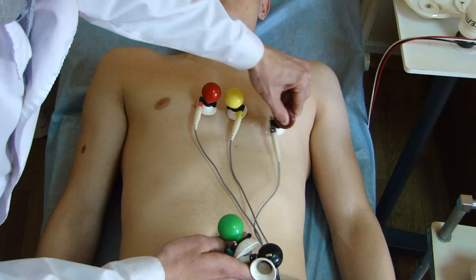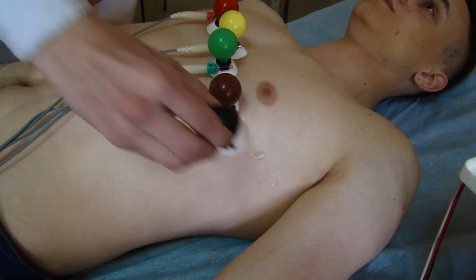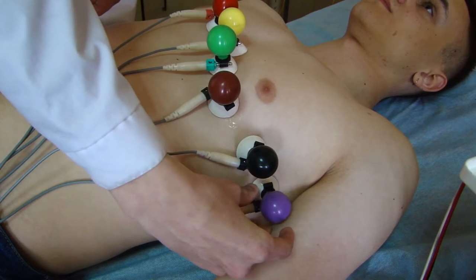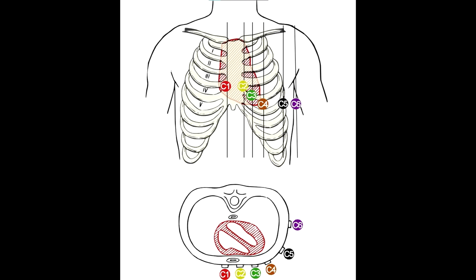Fourth electrode – brown, fifth intercostal space along the midclavicular line on the left side. Third electrode – green, applied after the fourth electrode, in the middle between the second and fourth electrodes. Fifth electrode – black, fifth intercostal space along the anterior axillary line. Sixth electrode – purple. The layout of the chest electrodes will look like this.